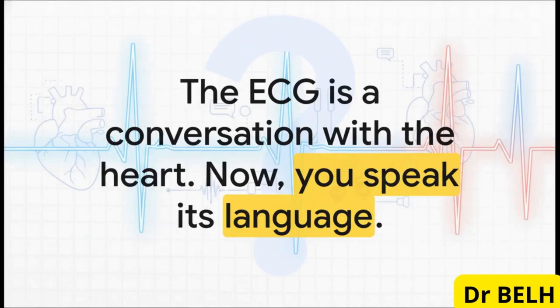I want you to remember this. An ECG is not just a bunch of lines on a piece of paper. It's a language. It is a direct conversation with the most important organ in the human body. And after today, you're no longer just looking at it. You are an interpreter. You now understand what the heart is trying to tell you.